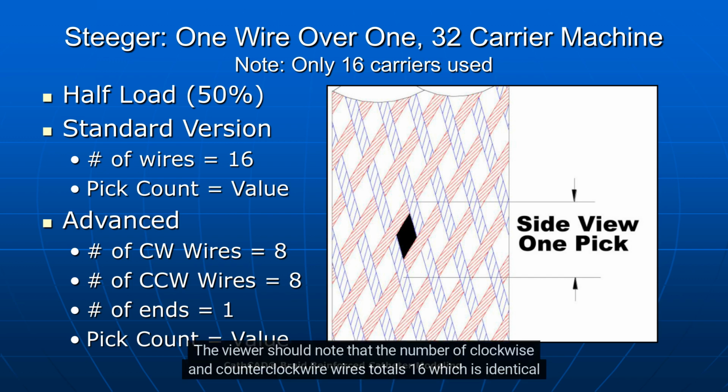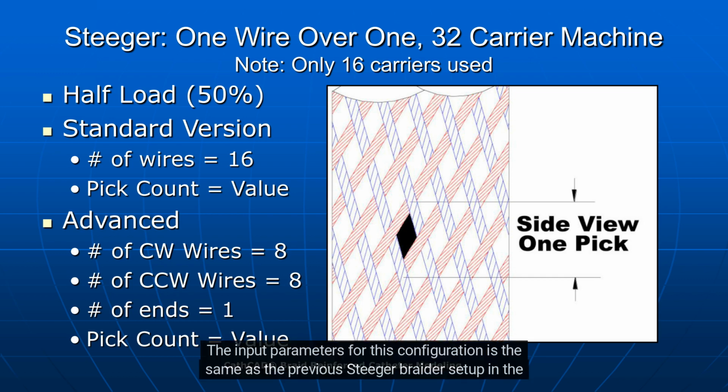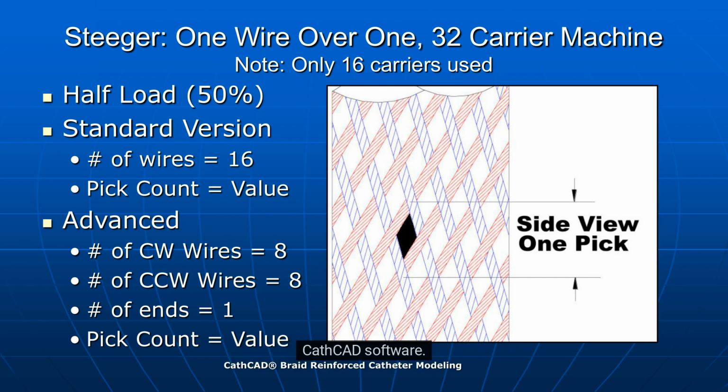The viewer should note that the number of clockwise and counterclockwise wires totals 16, which is identical to the value entered into the standard version of CathCAD. The number of ends is set to 1. The pick count entered should be that of the desired value. The input parameters for this configuration are the same as the previous Steger braider setup in the CathCAD software.